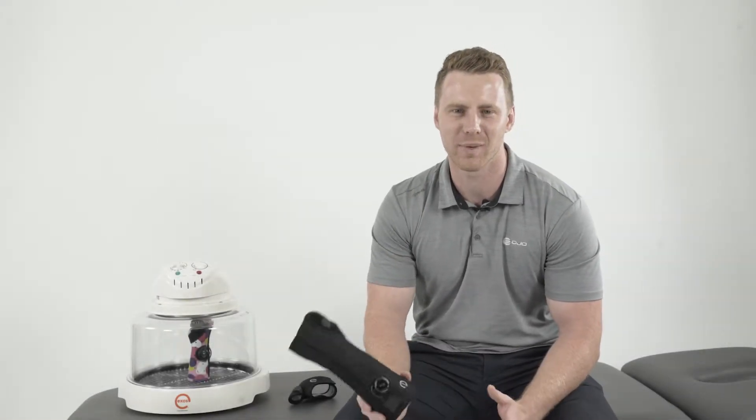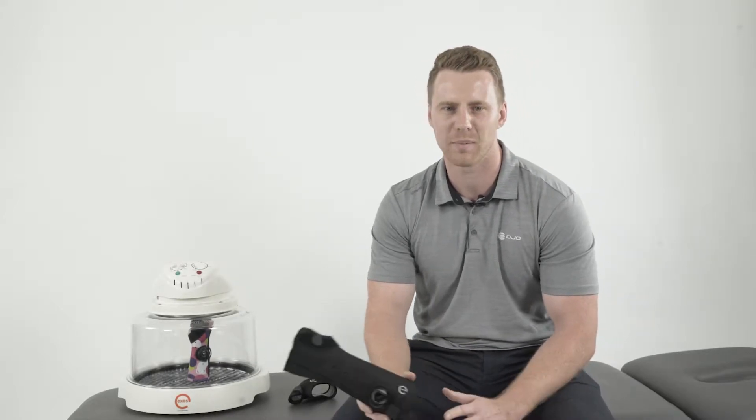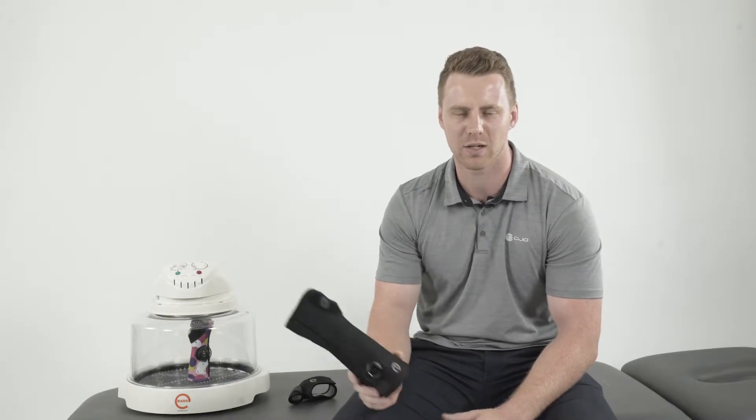I'm Andrew, a registered physio and territory manager in New Zealand for DJO. Today we're going to go over the theory and practical application behind our Exos braces.